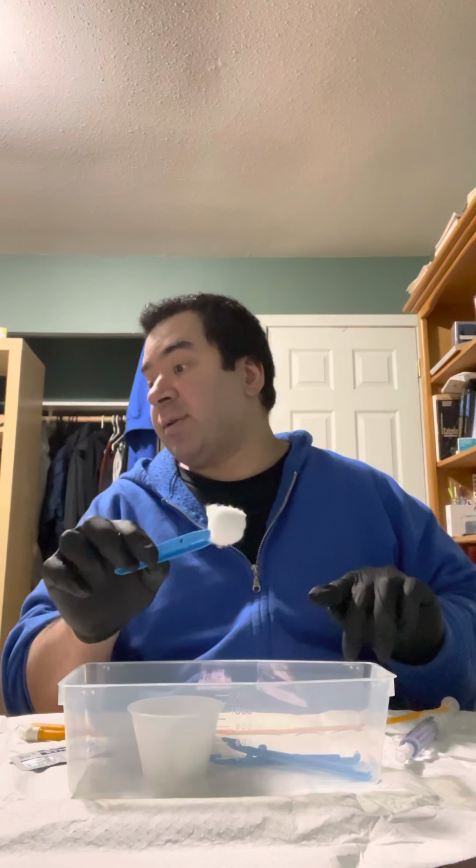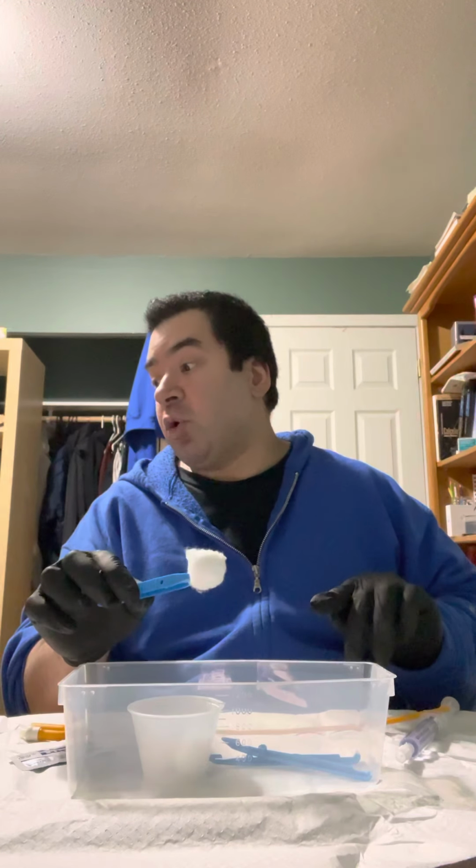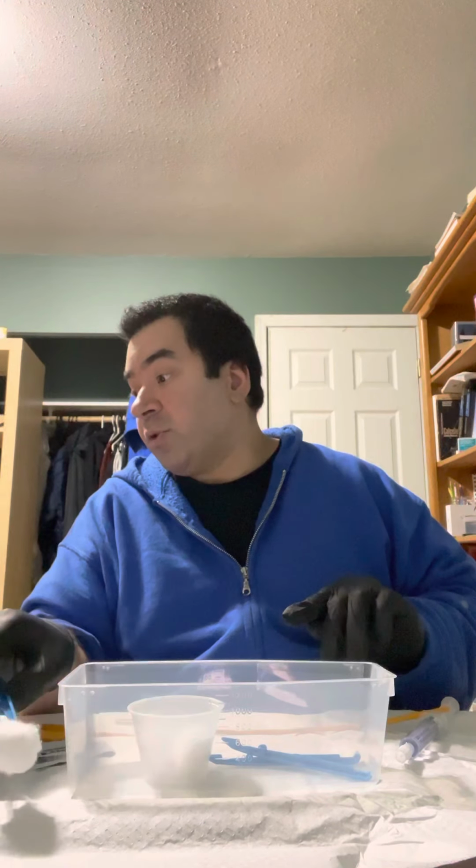With my uncontaminated dominant hand, I will use forceps to pick up the cotton balls. And I will move in circular strokes, beginning at the urinary meatus, moving out in a spiral fashion. I will repeat this process 3 times using a clean cotton ball or swab stick each time. I will dispose of the cotton balls so that they do not contaminate the sterile field.